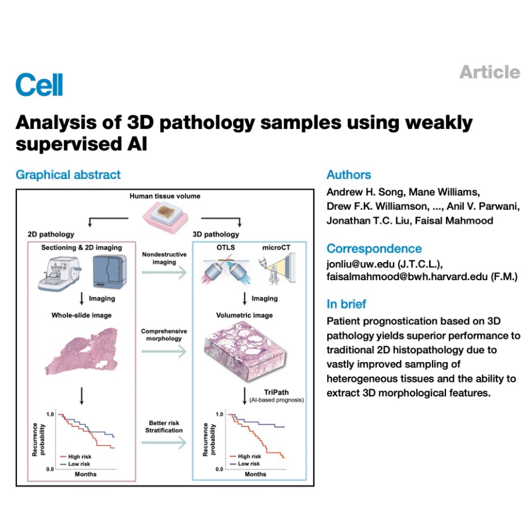Precisely. And conversely, the patches with strongly negative scores, the ones indicating good prognosis, tended to show large, well-formed, benign glands, sometimes with these little calcifications called corpora amylacea, again, features associated with benign or less aggressive tissue.